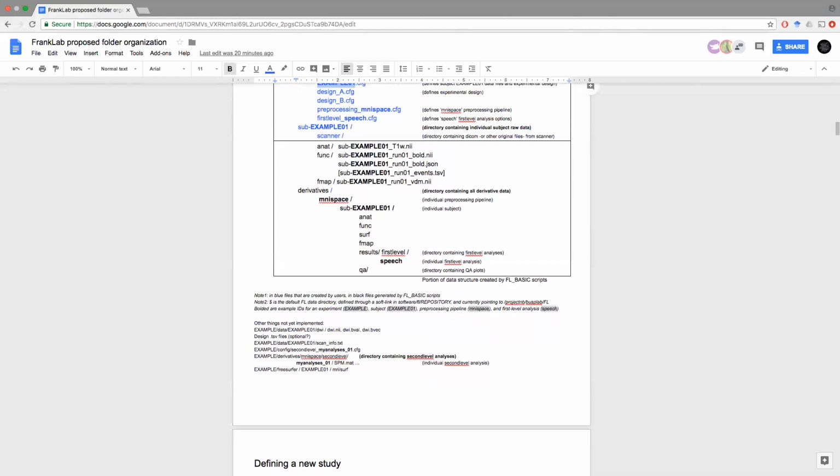Okay. The reason I asked that is so that you can cut down on having two sets of subject info files. Right. Two sets of subject info files for the two pipelines, you mean? Right, definitely, yes. You can enter just a single subject info file containing the actual T1 structural file and the standard functional data, and that will work for any pipeline that you use. You're exactly right. Okay.